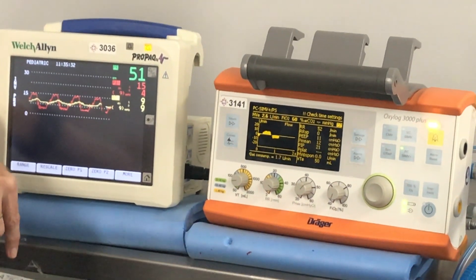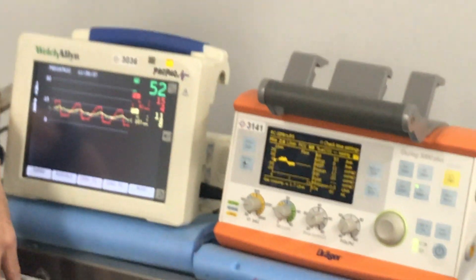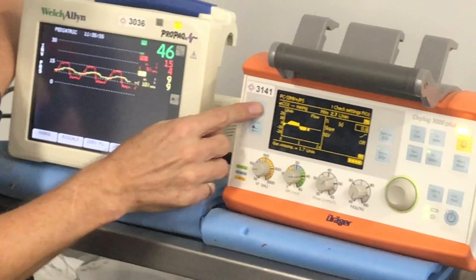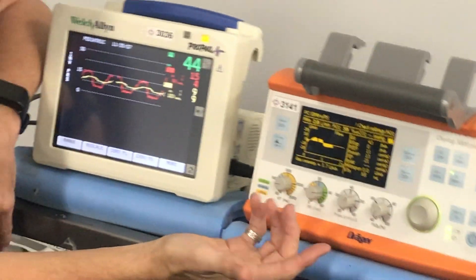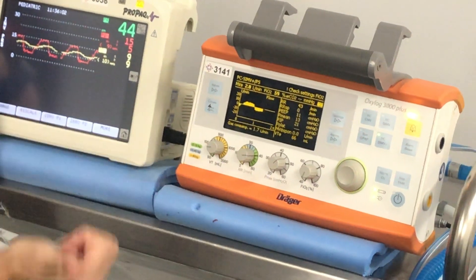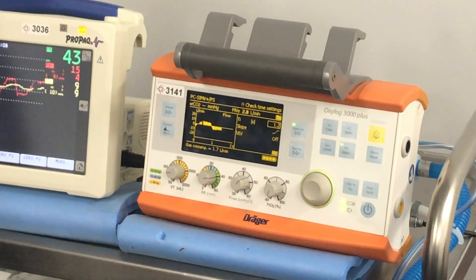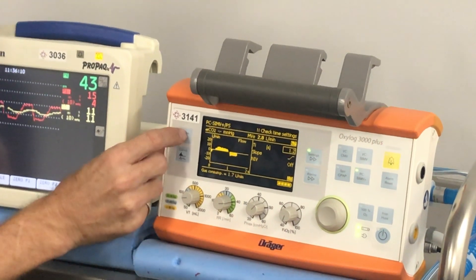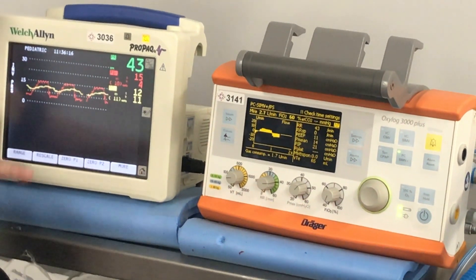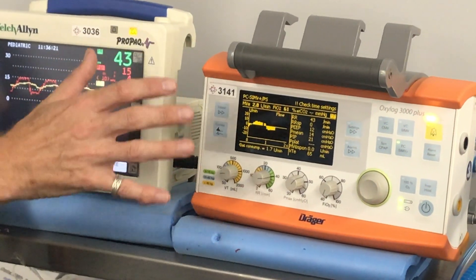We've tried manipulating our pressure and our rate. The next suggestion was I-time. So what would you do to your I-time? Let's go back — tidal volume is 65, still on rate 40 with pressures of 25 on 5. We're going to try adjusting our I-time to 1.2, giving it more time to allow flow through. We got a slight improvement — about a 10 to 15 mL change in volume — but not a vast improvement.